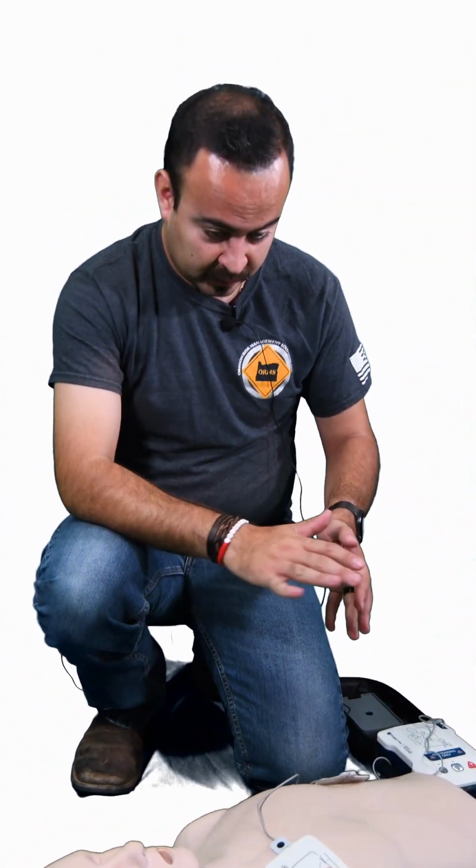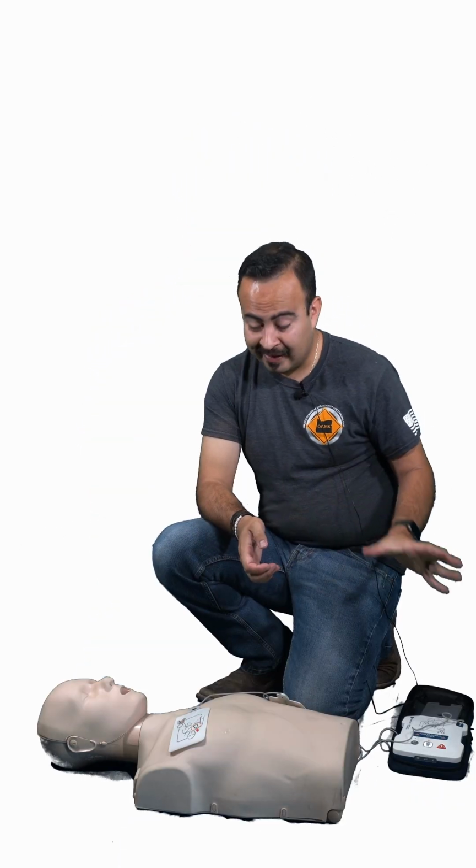Also, you want to make sure that your victim's chest is clear. If it is wet, you want to dry it off with the rag as quick as possible. It doesn't have to be perfectly dry, but dry enough. Next, if your victim has a hairy chest, you can use the razor that comes with an AED or with most AEDs out in the field. Or if your AED has a second set of pads, you can use the first set of pads to yank off the hairs.